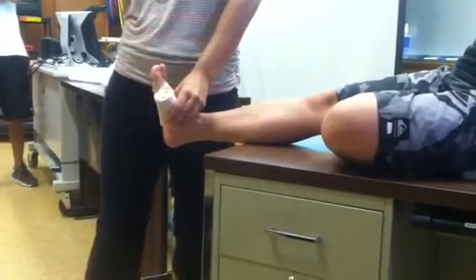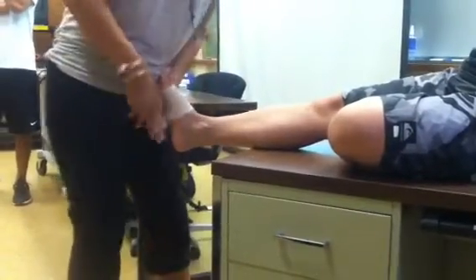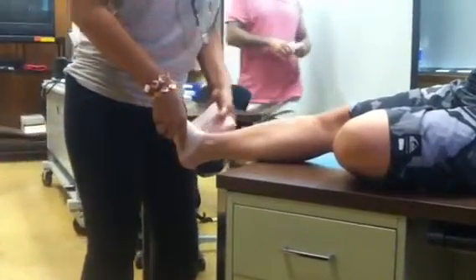Spica, we're doing a little X crossing motion. So make sure you guys can see this. It's going to happen on the top of the ankle. So I'm going to come up and around, slightly going upwards. And when I come back around, I'm coming back down for the first spica. The second one, I'm doing that same pattern.